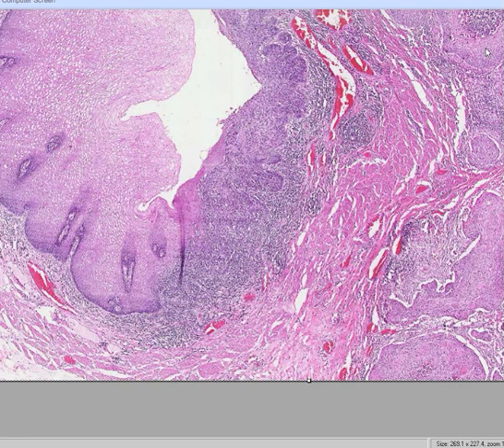And Rick, if it arose from the lower part of the esophagus, what benign disease would have probably preceded it? Right, GERD. Well, GERD is the clinical disease, but what's the pathologist's disease? How about Barrett's esophagus? Because chronic GERD, you're right, can be a prelude to Barrett's esophagus, but Barrett's esophagus is the tissue word, and Barrett's esophagus almost always precedes adenocarcinoma.